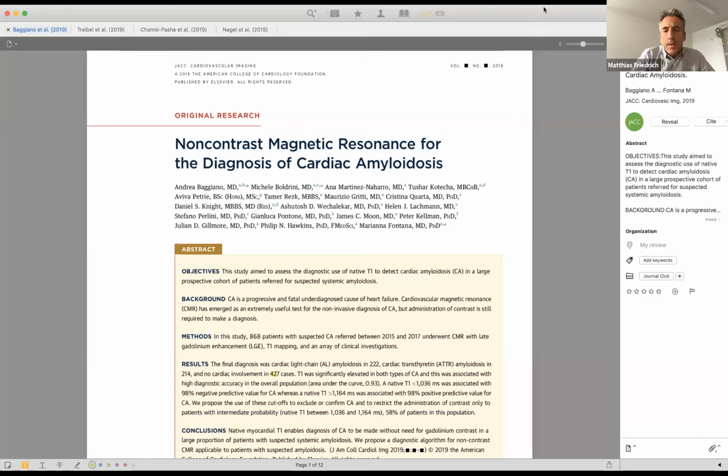level of accuracy. At least that's what we currently think. And therefore, but ECV has the disadvantage that ECV needs a contrast agent, because you need pre and post contrast T1. So these are very important questions, especially I think about the future.